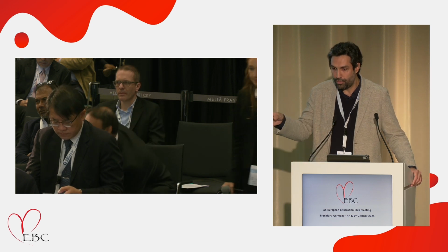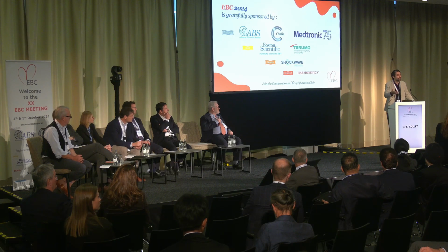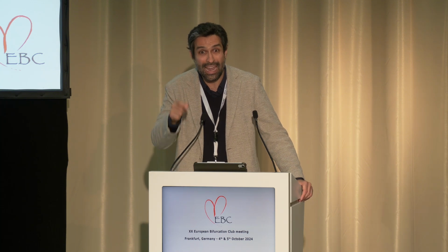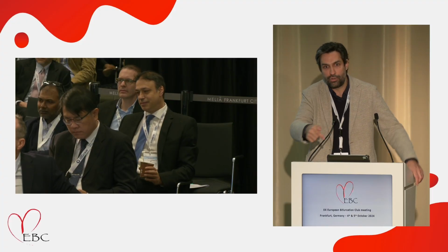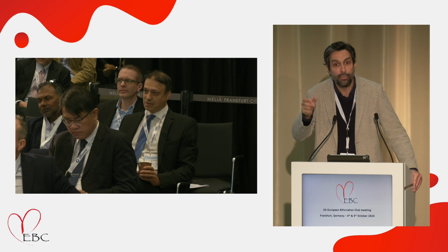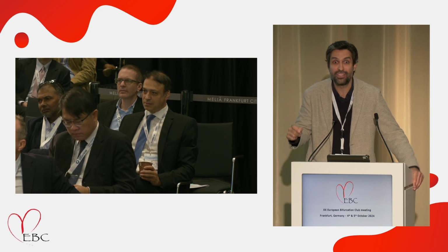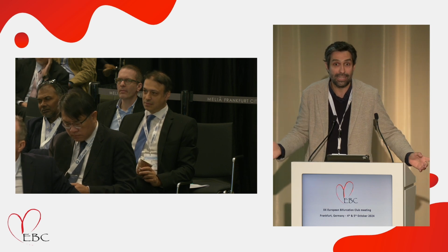A few days ago, I was in a similar meeting, but with radiologists. The reason I was talking to radiologists is because they need to understand how important it is to give nitrates to the patients, because we're now doing sizing. If they don't give nitrates and you do, that's going to be different. They also need to set up the tube in a way that allows them to assess the calcium, because what they have been doing so far is reducing the radiation at the expense of getting this blooming artifact, so that you cannot read the calcium.